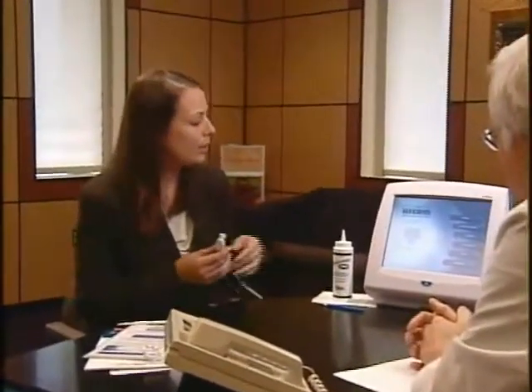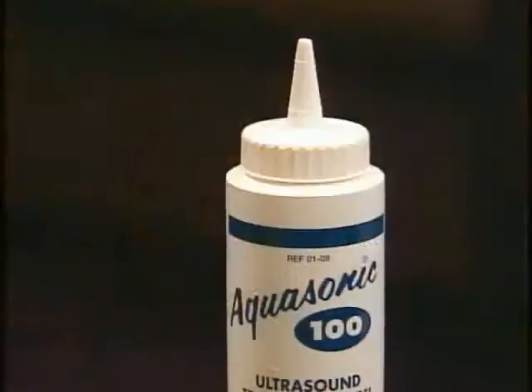This is the probe. It works in both kids and adults. It's 2.2 megahertz. All you need, the only disposable, is the gel. The probe can be placed in the suprasternal notch or the left parasternal edge. It measures flow either through the aortic valve when you place the probe here or through the pulmonic valve, so you can assess left and right-sided function with the Uscom, which makes it unique.